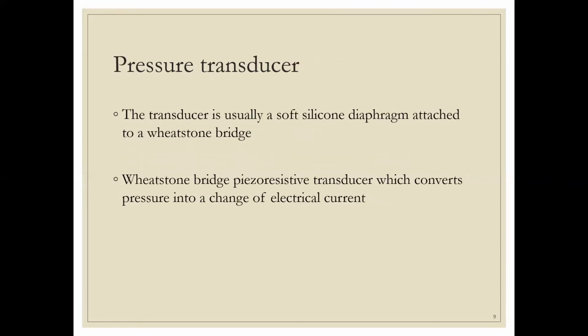Now coming to the pressure transducer. The pressure transducer is the device where this recording of the pressure happens. So whatever oscillation or pressure changes are happening in the blood, and then in the saline, get transmitted to this transducer. Now the transducer has a silicon diaphragm. So at this diaphragm level, the kinetic energy which is present in the saline will get converted to electrical energy. And subsequently, this electrical energy goes to the anesthesia monitoring device where the processing happens and we then get digital data out of it.